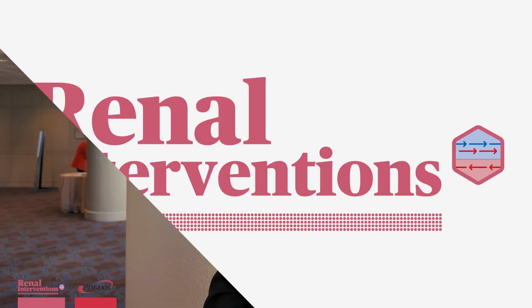And grafts mature wonderfully, and they don't get infected like catheters do, but the problem is they need lots and lots of interventions. So what does that mean, lots of interventions? They require, on average, an angioplasty about every 3 to 6 months. And that is an incredible burden on patients. And so I don't look at it as the realm of a surgeon or the realm of an interventionalist. They're all our patients. They all have lives that we're disrupting by doing lots of procedures.